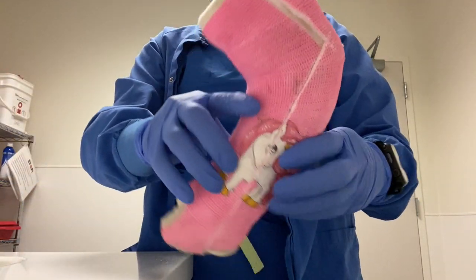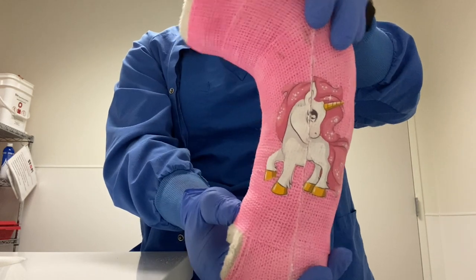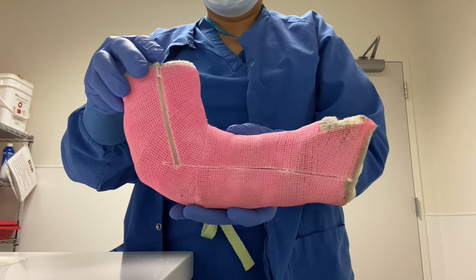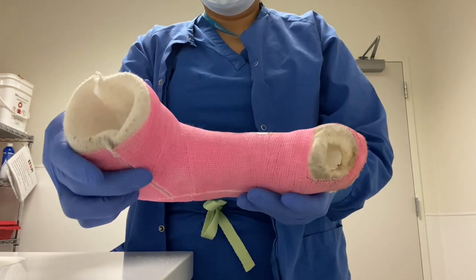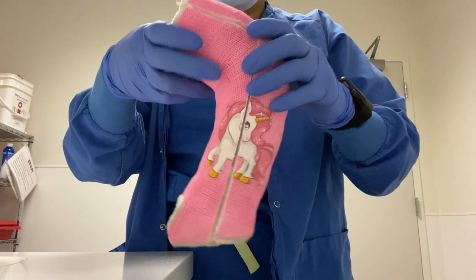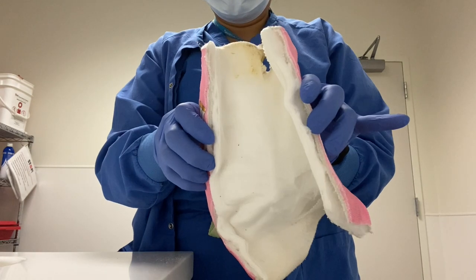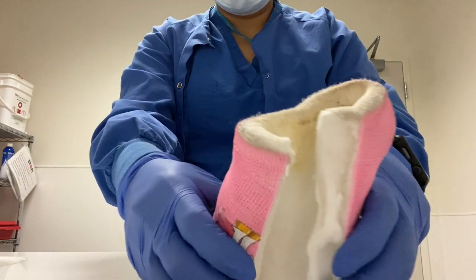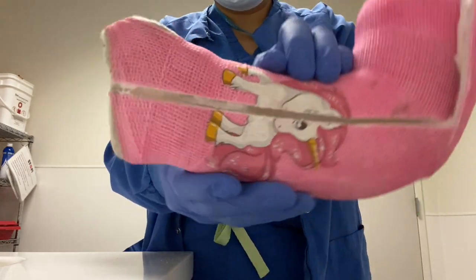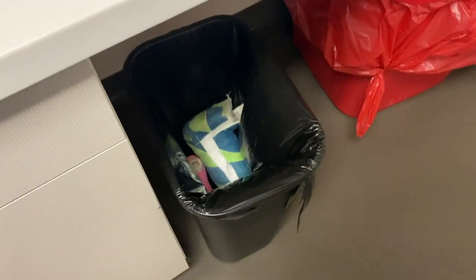Here I removed a long arm cast that has a unicorn on it. Unfortunately I had to split the unicorn to be able to remove the cast properly. I actually applied this cast, so I was so happy to see the patient back and remove the cast for them. Unfortunately the little girl did not want to keep her cast, so I threw it in the trash.